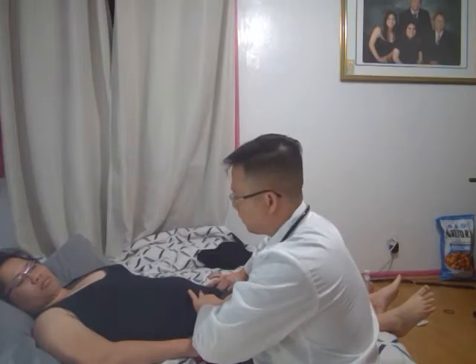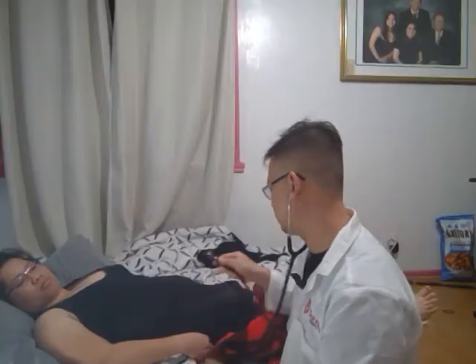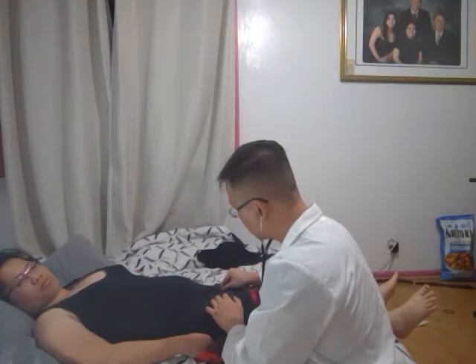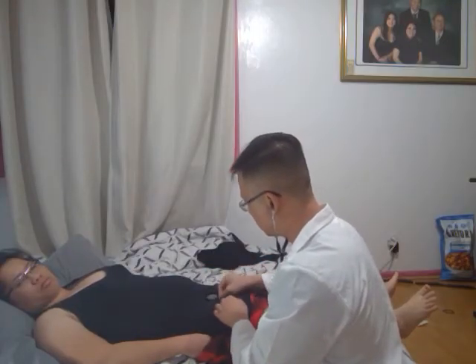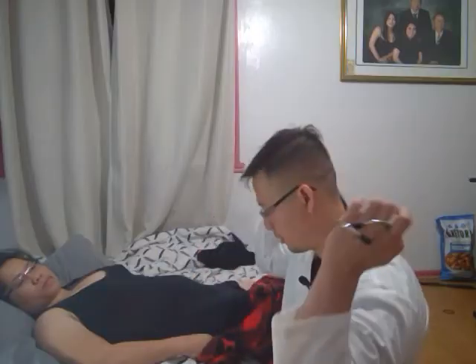I feel the femoral on the thigh, 2 plus bilaterally, and then I listen to the femoral with the diaphragm and the bell. There is no bruit, no swooshing sound, bilaterally, left and right femoral artery.